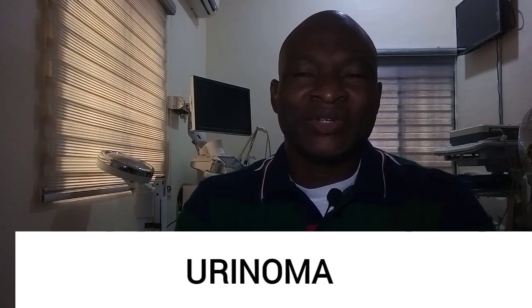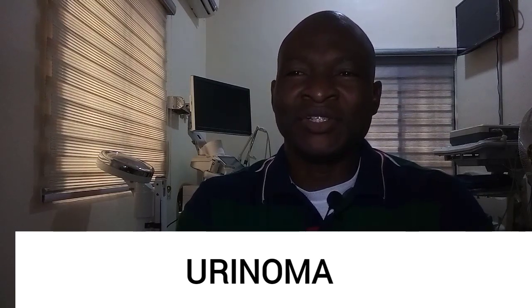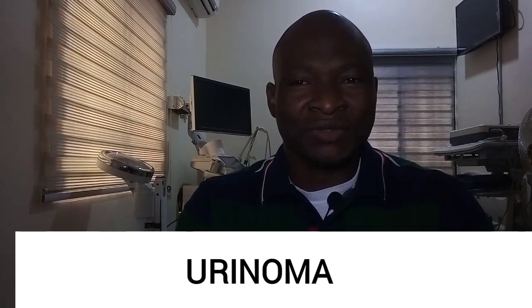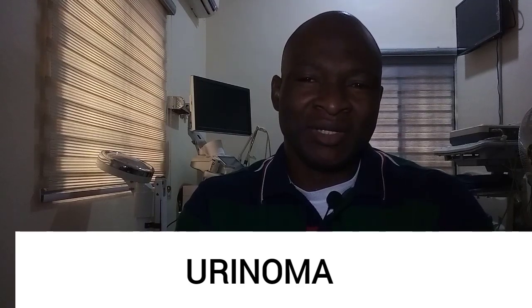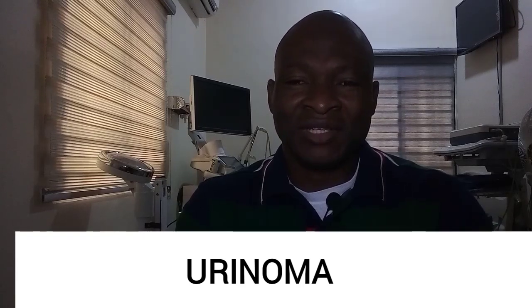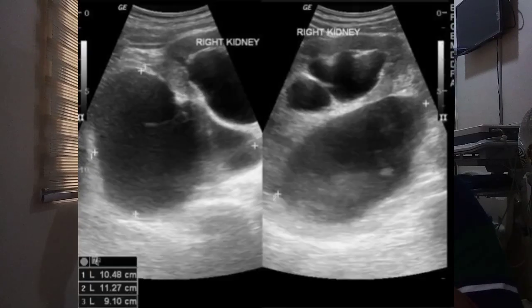Urinomas, a collection of urine commonly localized in the perirenal region. Usually they will result from trauma, interventional procedures, or high-grade acute ureteral obstruction. Also occurs as an early complication of renal transplant. Sonographically, urinomas are usually anechoic and well-defined cystic masses, and they may show septations. And this is an example of urinoma, and you can see the right kidney is showing signs of hydronephrosis.